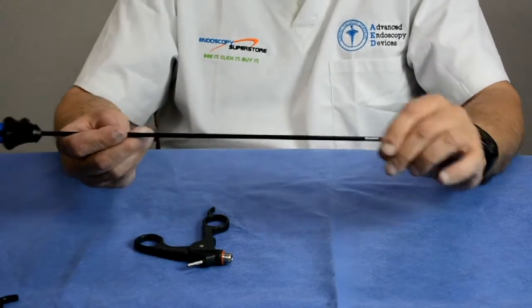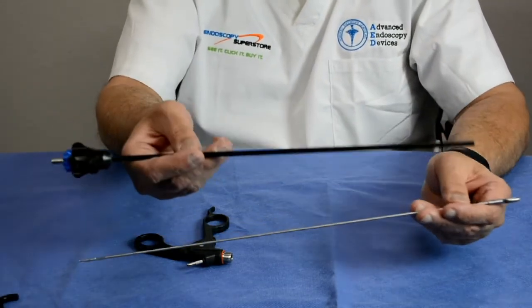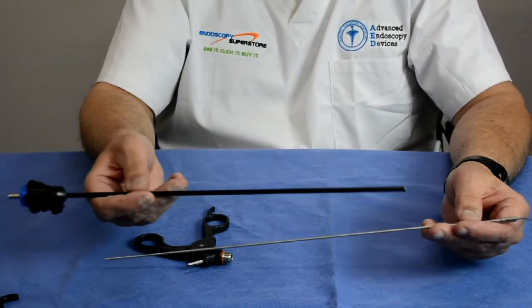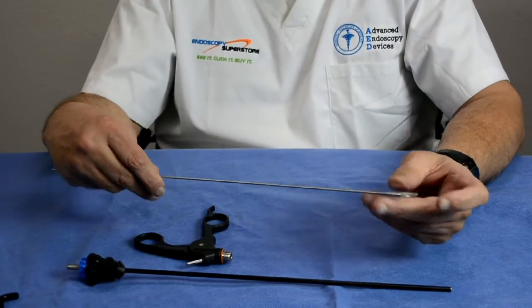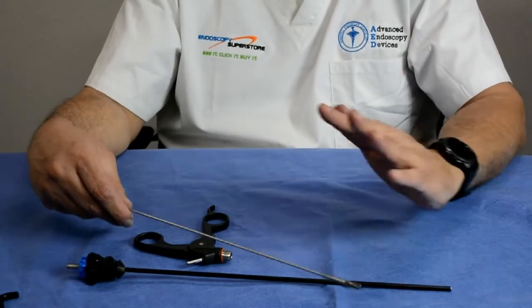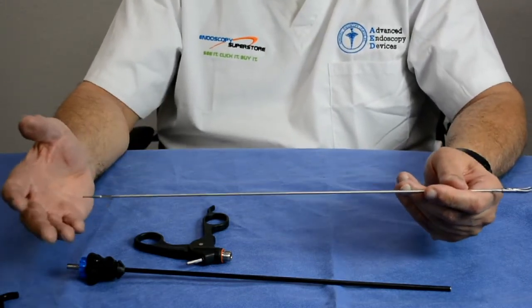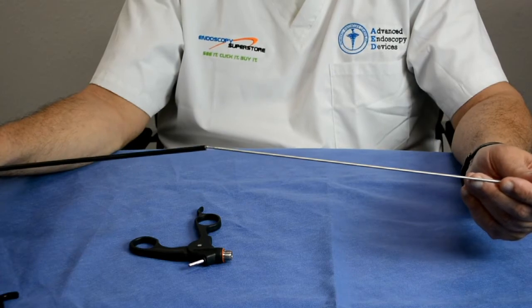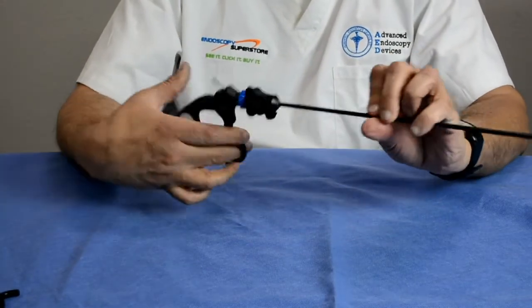The premium line is also completely modular, so you can purchase additional pieces and only replace damaged components right in your SPD department without sending anything out. It features 100 different jaw configurations, including over ten scissor styles — from micro scissors to serrated, curved, straight, and pointed scissors — plus graspers and more. With the different combinations available, you can make 8,000 different combinations of this forcep to meet all your surgeon's needs in handle style, jaw pattern, and length. It's very easy to assemble — just turn it and it's ready to go.